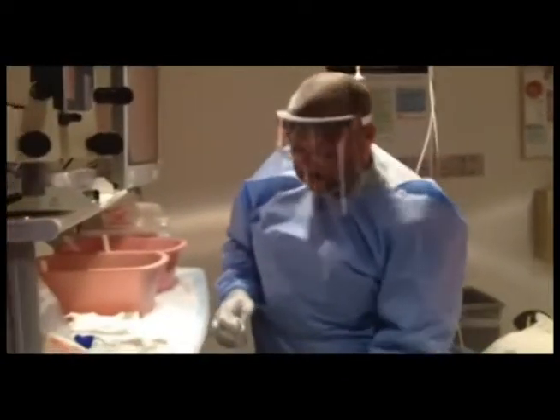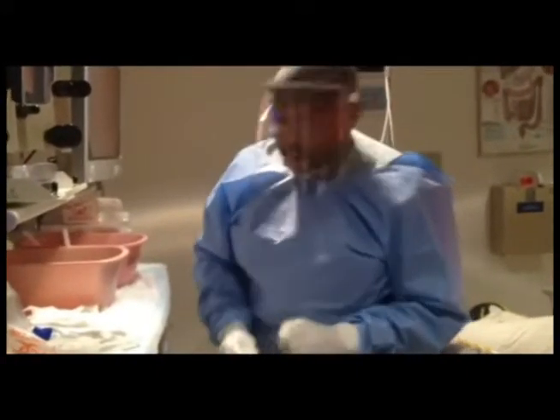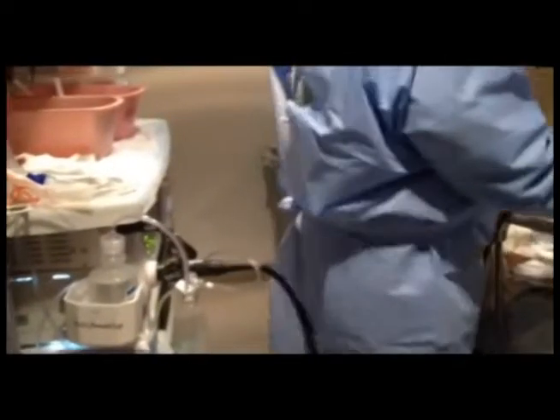We're going to do the endoscopic pancreas function test and I wanted to show you how we collect one of our samples. This is a healthy volunteer for our proteomic analysis studies. The first thing we do is we attach a specimen trap. This is our 45-minute collection. We'll attach the trap onto the scope, then advance the scope down.